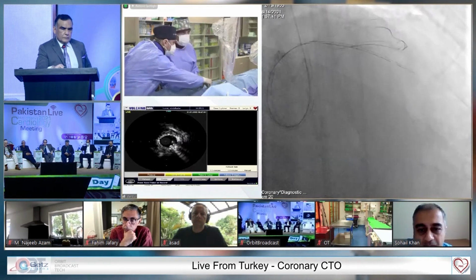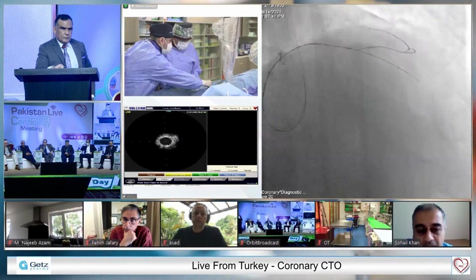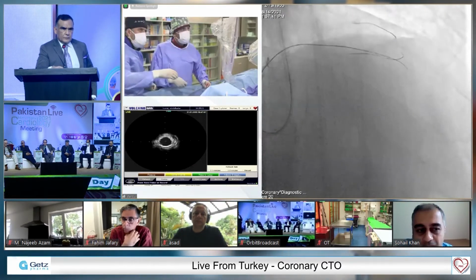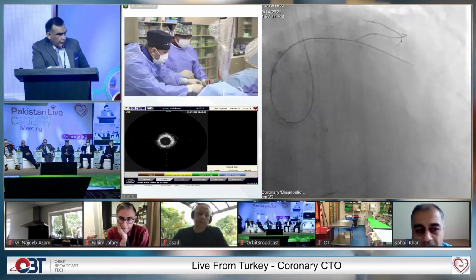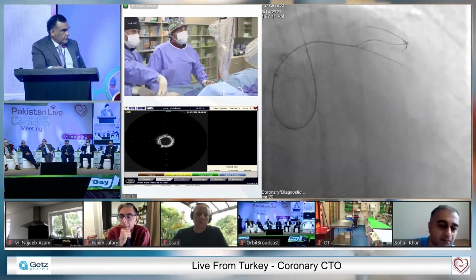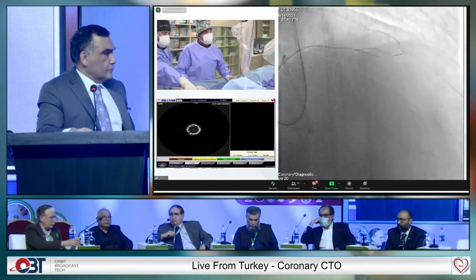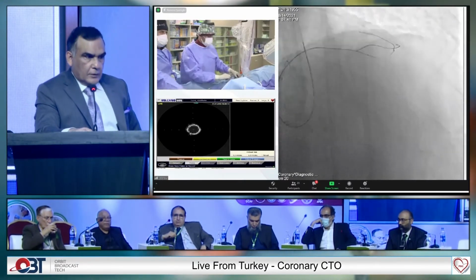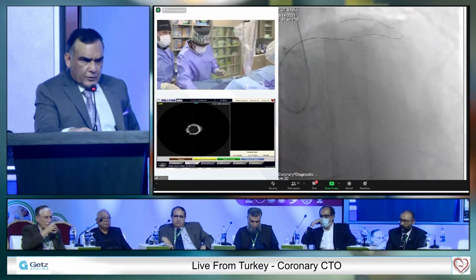Okay. Anyone from the panel want to ask him anything? Would you take a microcatheter? I think it's either Fine Cross or Corsair.